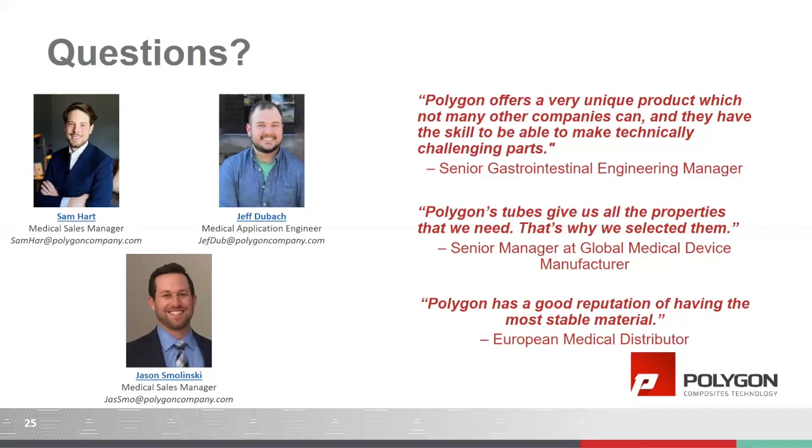How does the strength of composites compare to stainless steel? Depending on the fiber and resin used to produce the composite, the mechanical properties can vary some. We found that using fiberglass with thermoset resins has been shown to provide ample strength to meet the device requirements.